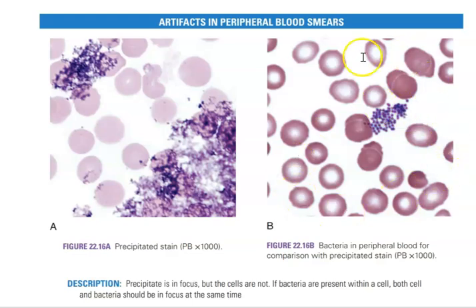Next up is figure B. This would be bacteria on your blood smear slide. Of course, if a patient has bacteria in their blood, that's clinically significant, because bacteria should not be in a patient's blood. But as far as making a blood smear slide and counting cells, it would be considered an artifact for counting cells purposes. And if your red cells are in focus, the bacteria should be in focus.